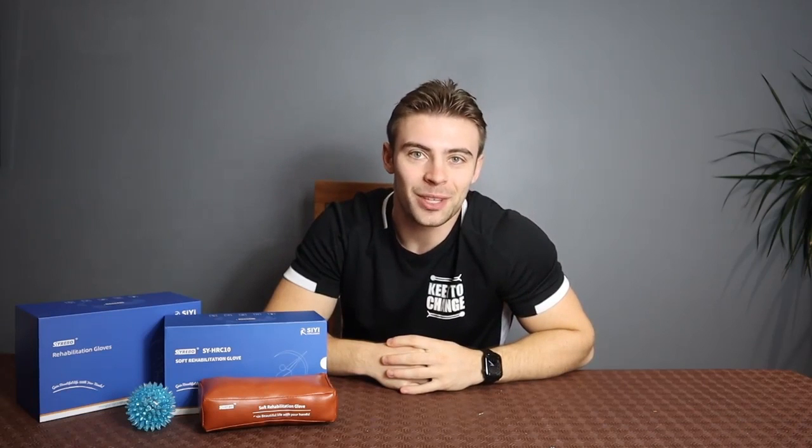Hello everyone at Keen to Change. I've recently collaborated with CyreboCare, who have sent me one of their great rehabilitation gloves. Today we're going to have a quick unboxing of what we've got inside here, and we'll give you a quick showcase of what the glove actually does later on in the video.